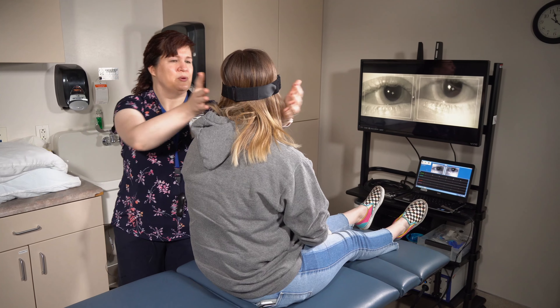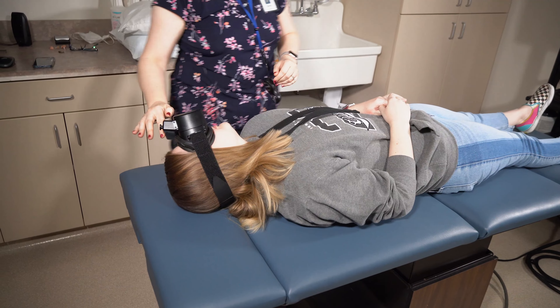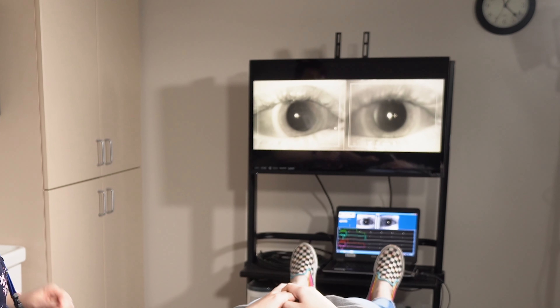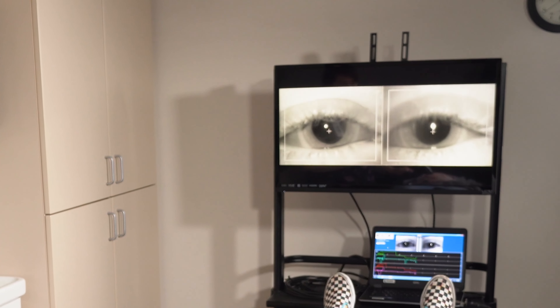On the count of three we're going to lay you back — one, two, three. Lay back, just let your head rest there, keep your eyes open for me. So if you had loose crystals in one of your semicircular canals, your eyes would be bouncing all over the place on the screen, so we'd keep you here for about a minute.